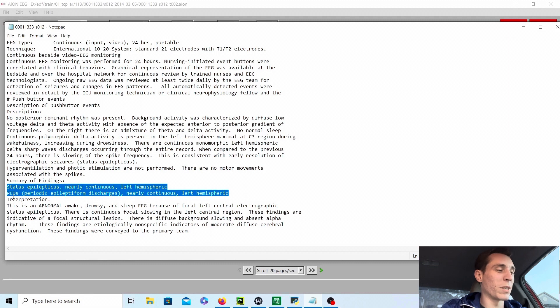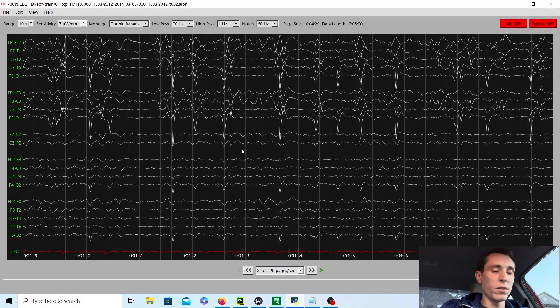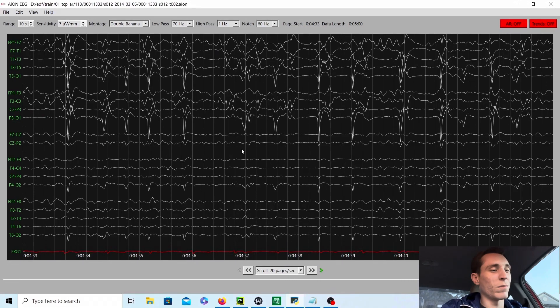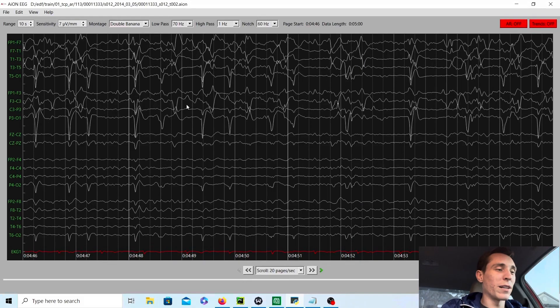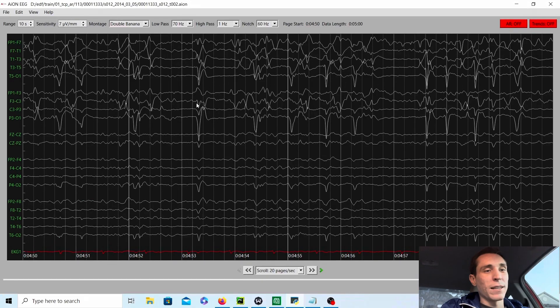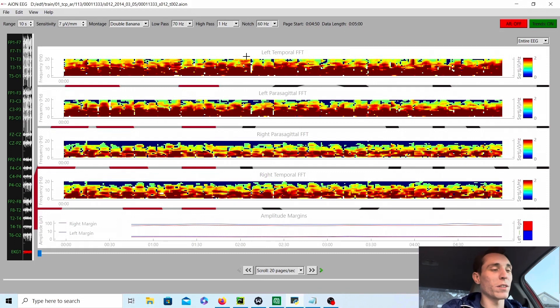Periodic epileptiform discharges, lateralized to the left side — left hemisphere. That's what the doctor had to say about this record. So one thing you'd do while monitoring this patient, as the doctor adjusts medications trying to stop these lateralized periodic discharges on the left side, is look at the trends of the brain data over a long period of time. This record is just a five-minute clip, but you'd monitor multiple hours and days.